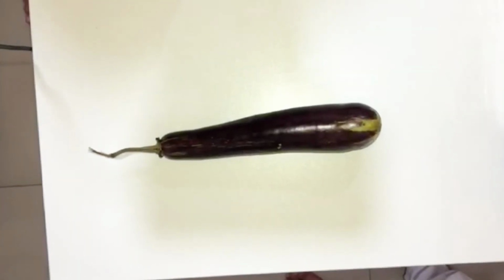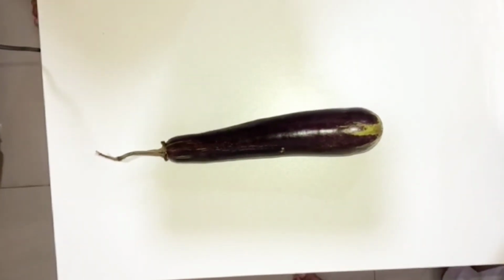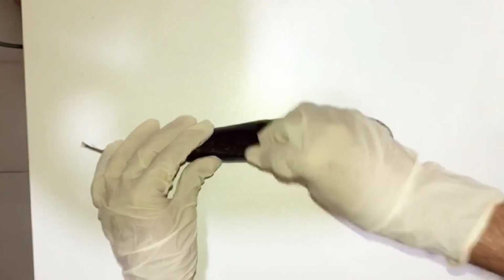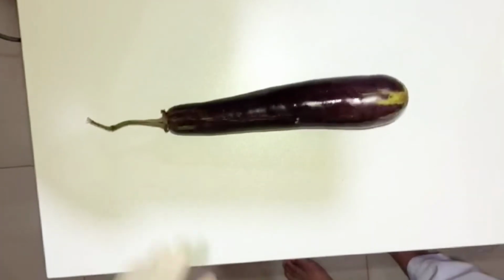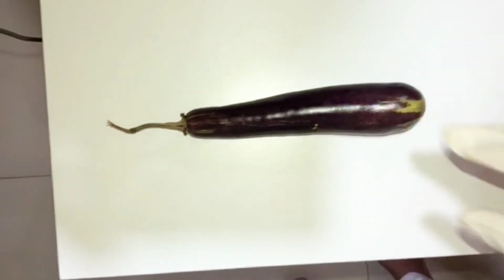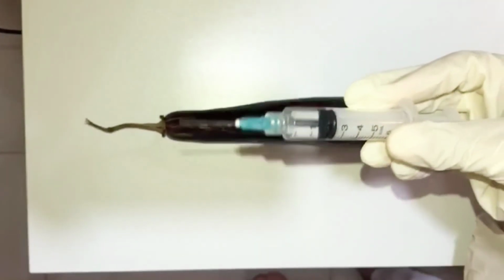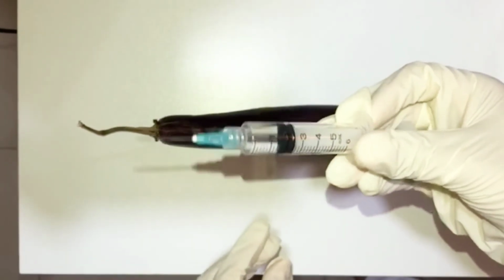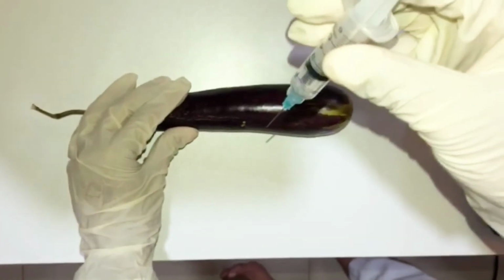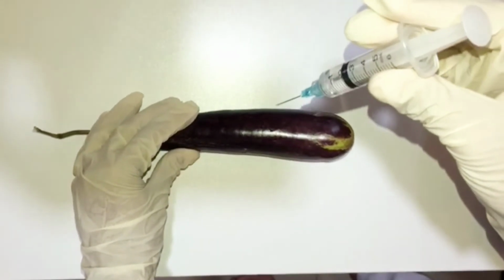Apply clean gloves and use anatomical landmarks to find the site again. Disinfect the injection site in a circular pattern from inner to outer, about 2 inches. Hold the gauze pad between the third and fourth fingers of your non-dominant hand. Remove the needle cap by pulling straight off. Hold the syringe with the thumb and forefinger of your dominant hand as if you're holding a dart.